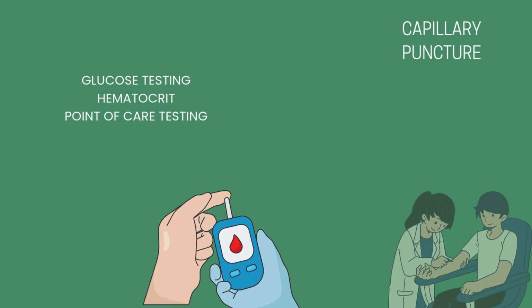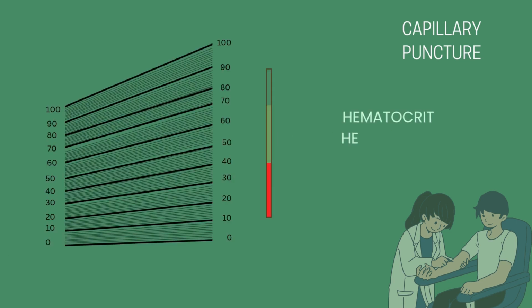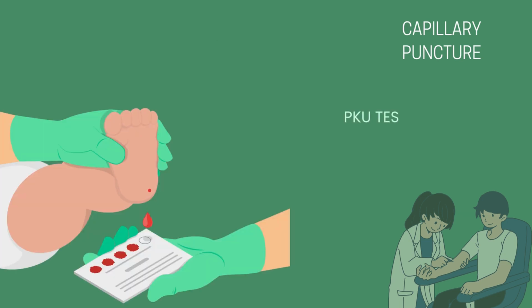to traditional venipuncture. One of the most frequent uses of a capillary puncture is for blood glucose testing, both in clinical settings and at home using fingerstick devices. It's also used to measure hematocrit and hemoglobin levels, which can help assess anemia or hydration status. In newborns, neonatal screening, which includes tests for phenylketonuria and bilirubin testing for jaundice disorders, uses a capillary puncture and is typically done through a heel stick.